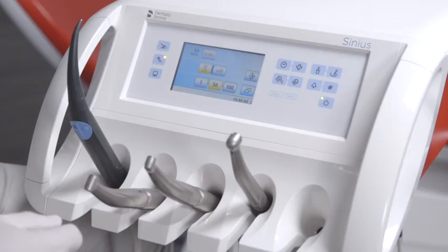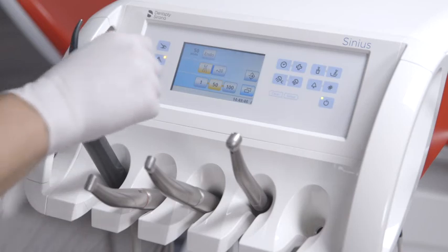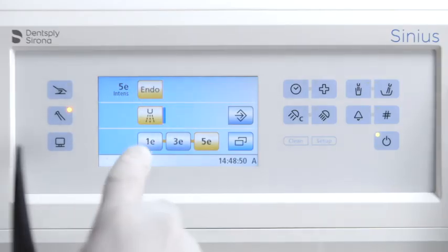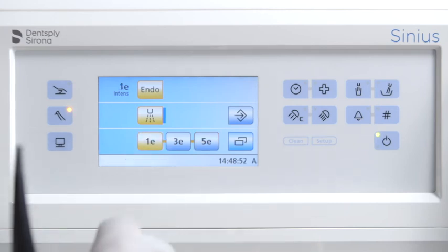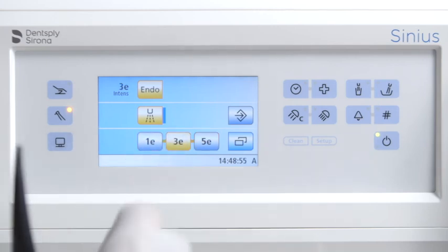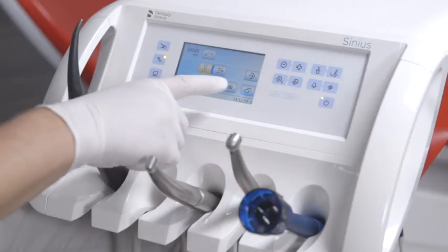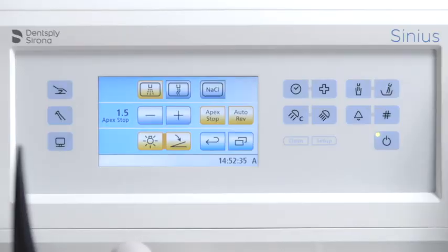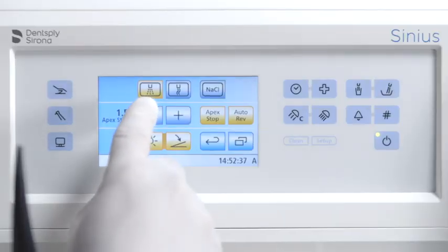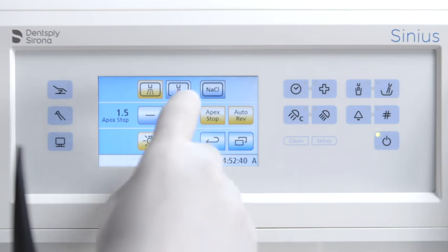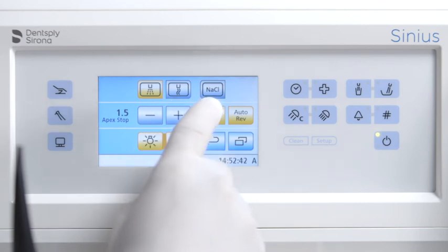The endo button is intended for endodontic treatment. The values are limited from 1E to 5E. The sub-screen button gives you access to additional subordinate functions such as spray coolant, air coolant, and NaCl saline solution.